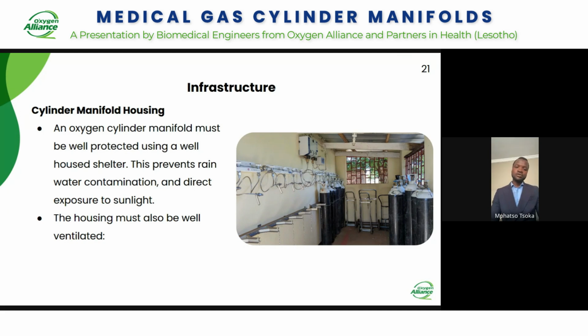I think just to reiterate what Dominic has said when he was talking about the terminal outlet for oxygen, medical air, or maybe if you're using vacuum, the fact that the terminal outlets are specialized and specific to the type of gas has also reduced the risk of using medical air, for example, or nitrous oxide on a patient that needs oxygen, because now the terminal is specific so that you can only plug in oxygen to that. Remember what used to happen when manifold and also pipeline were not there, where we were taking cylinders into the hospital wards, people could just see maybe the color of the cylinder, that it's black and white on top, maybe it's oxygen, but you find that there was no oxygen in it, and then you give it to a patient that doesn't need that type of gas that is inside.